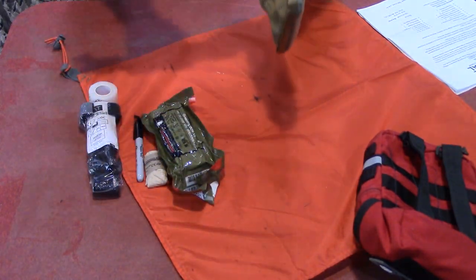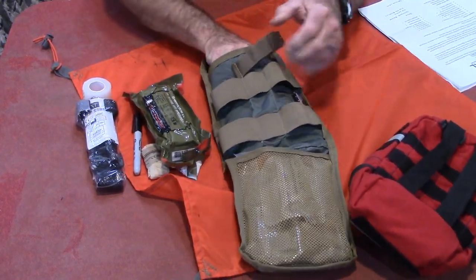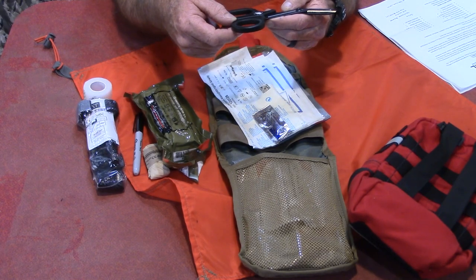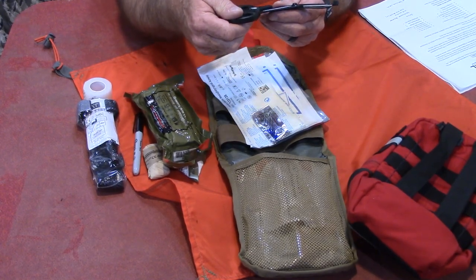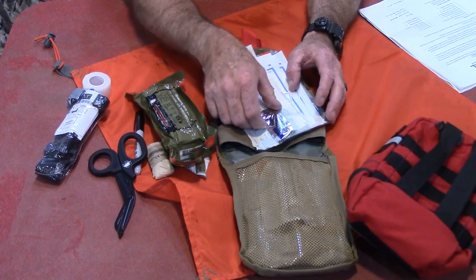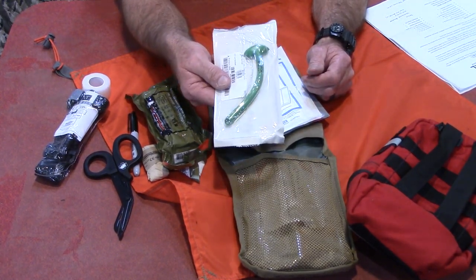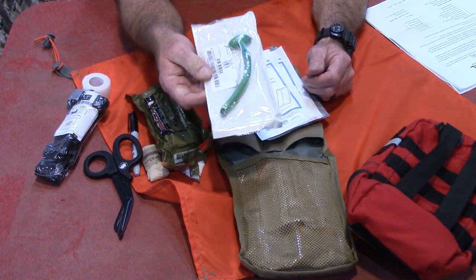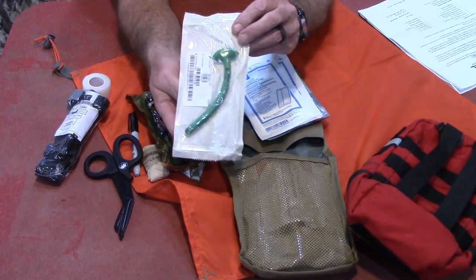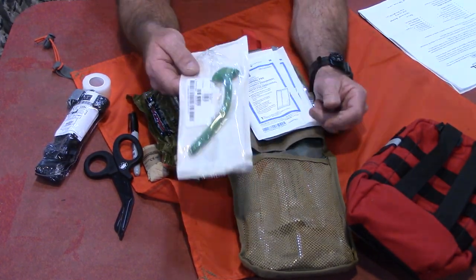Even the pouch itself is made in the USA. Looking further in, we have lubricating jelly and a nasal pharyngeal airway — number 28. This is a really good item to clear a blocked airway and ensure somebody can breathe — that's the second part of MARCH, airway. These things work and they're not that difficult to insert. I've had one inserted on me and I've inserted them in training. We also have two abdominal pads — absorbent, 5x9 — which you can use to apply pressure or absorb blood.